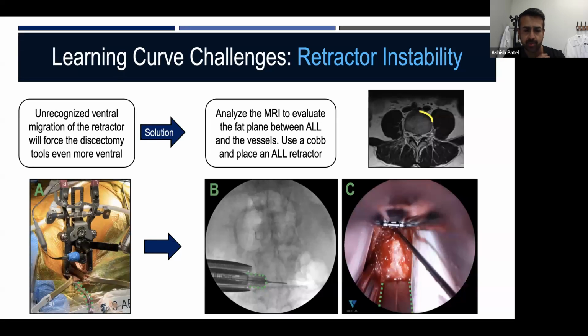Yeah. Are you doing any bolstering? No, I don't do double arm routinely, but for a larger patient or a difficult angle, the other time I'll do it is at the higher levels. So sometimes if you're doing a multi-level prone lateral, you start at the bottom, L4-5, you fight the crest, L3-4 is sweet. And, we can talk about that a bit later about what to start on. And then 2-3 is okay. And then you do a 1-2 and you're really fighting that rib. And that's where I find, if you're fighting the ribs, having 2 arms available can be very helpful.